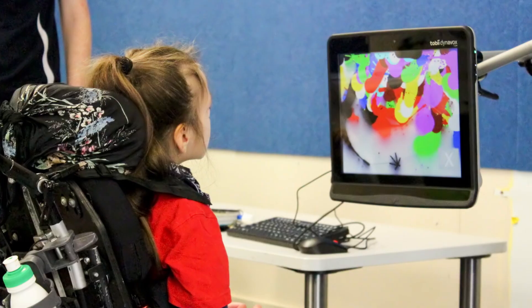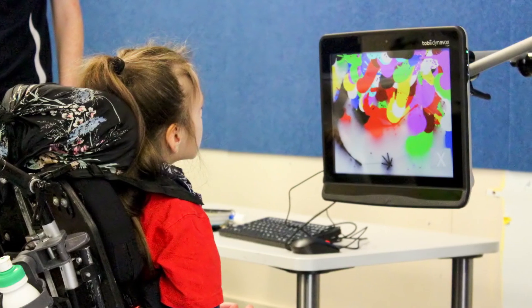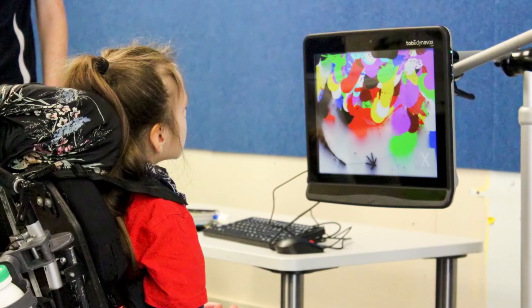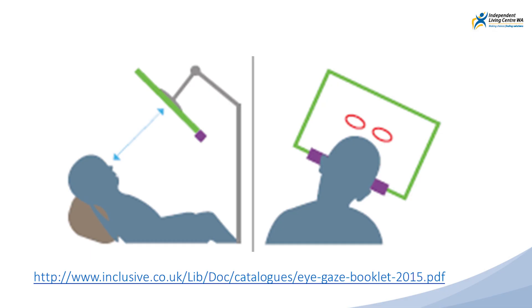Hi, I'm Tanner and I'm Jen. Getting the right setup and positioning for eye gaze is extremely important. The eye gaze camera needs a clear image of the eyes to work effectively. The system should be parallel with the student's face. This means if a student is reclined, the eye gaze system should be positioned on a corresponding angle in front of them.